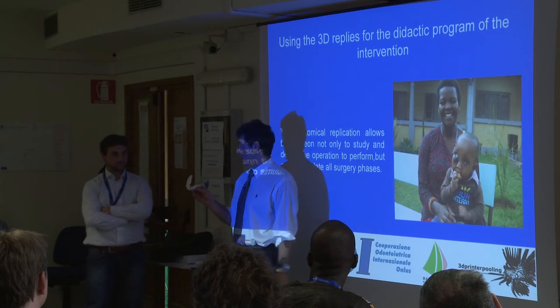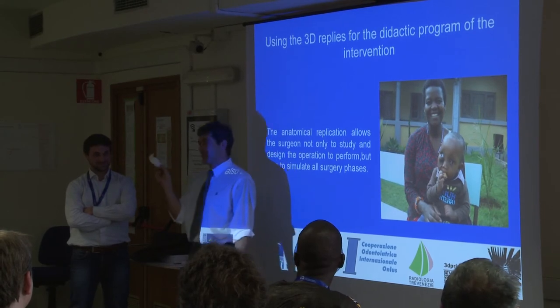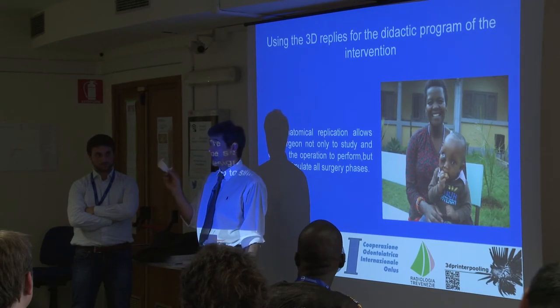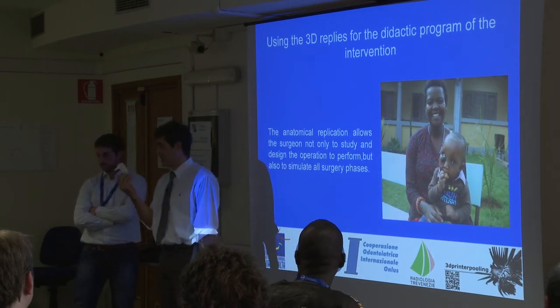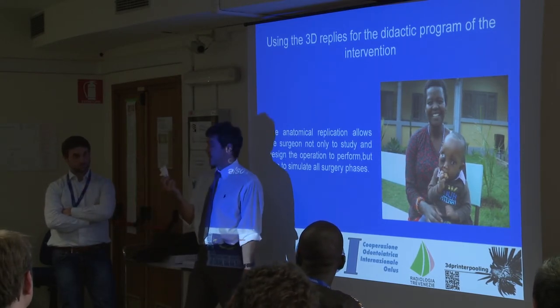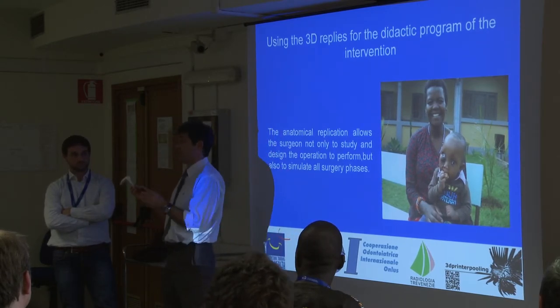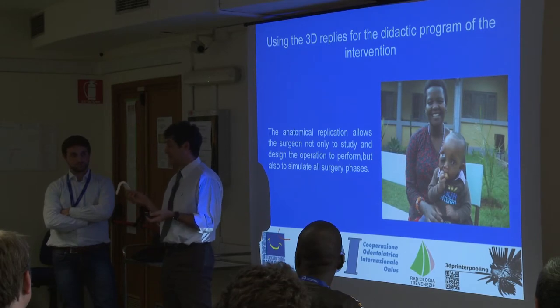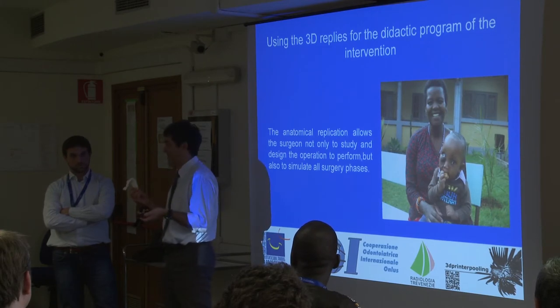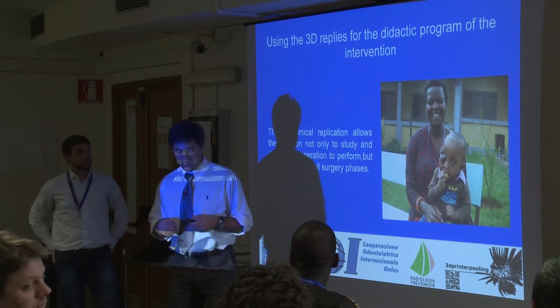I'm a dentist, and you know the dentists are not so cheap. So, for a dentist, this one in Italy nowadays costs about $500. It's not a low-cost technology, but nowadays we are able to do it with less than $1 sometimes, from $1 to $25. It's completely different. So it's my everyday job. One of these cases I operated this morning in my clinic. So there is the possibility to develop this.